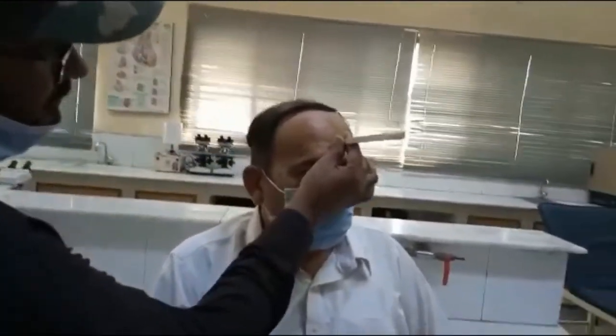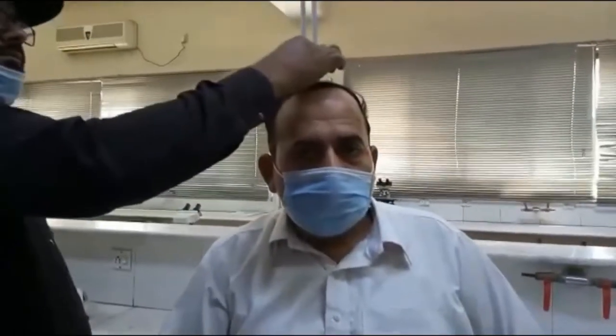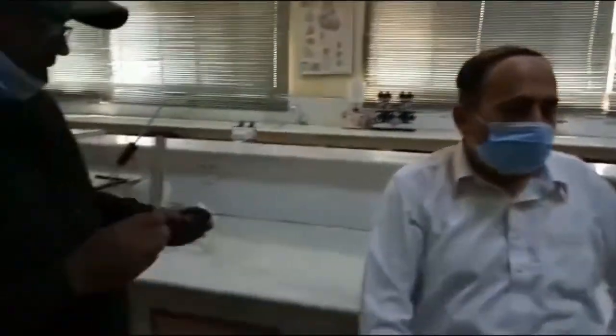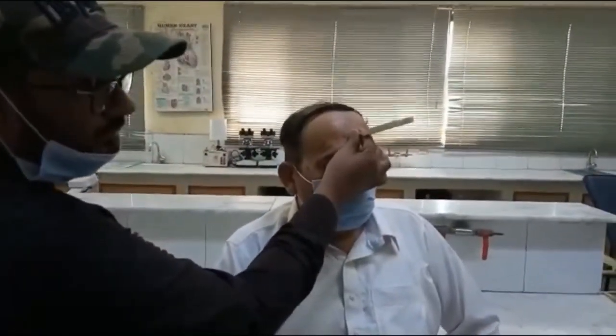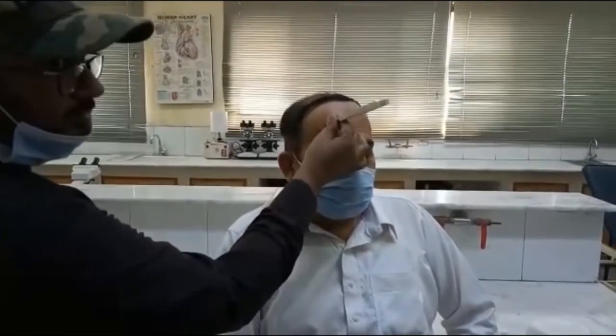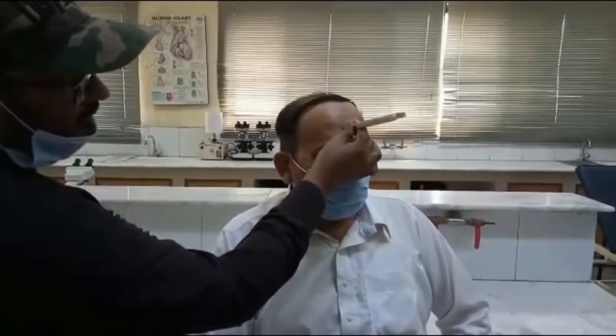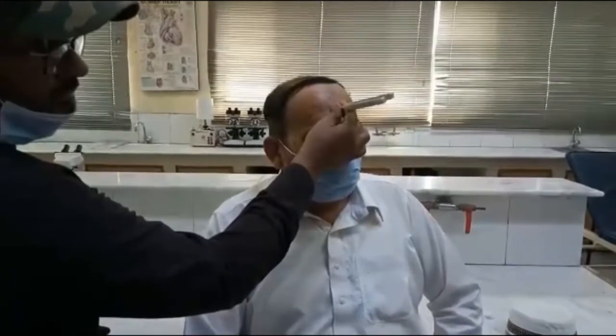For the Weber test, strike the tuning fork and place the stem either at the center of the forehead or the vertex of the skull. Ask the patient whether the sound is heard better in one ear or equally in both. If the patient hears it equally in both ears, this is a normal Weber test result with no lateralization.